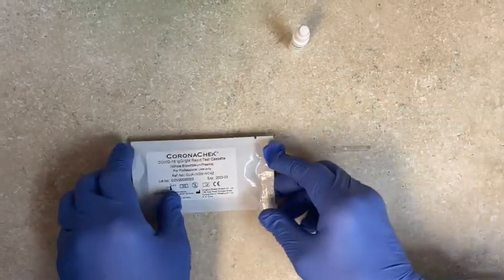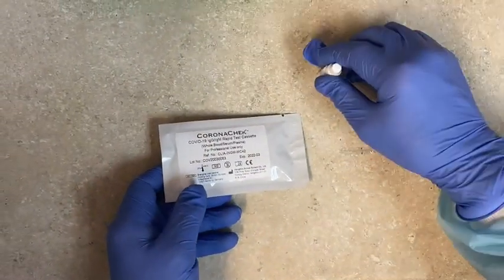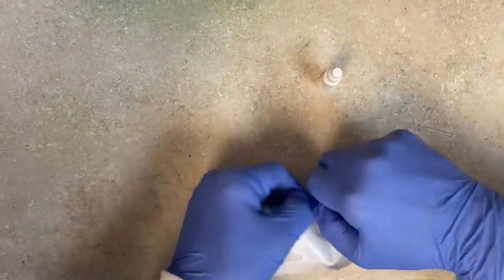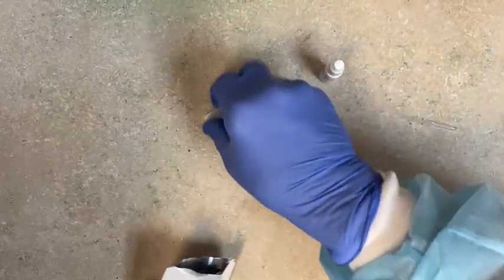Especially if you are collecting a specimen for COVID-19, it's imperative that you wear proper PPE. The materials you need are your Corona Check cassette, your buffer, and your micro pipette. Go ahead and take the cassette out of the wrap.